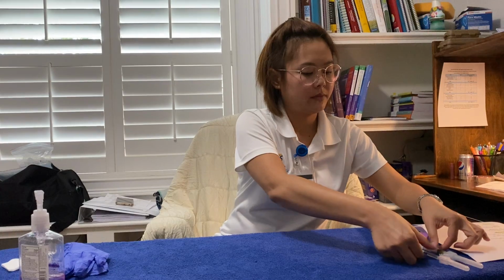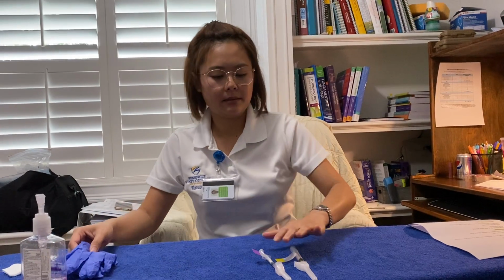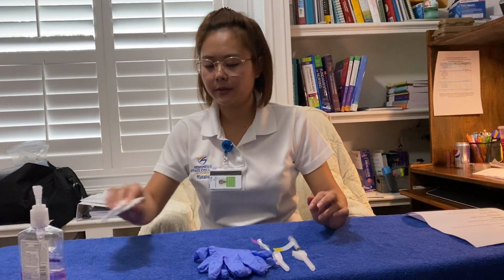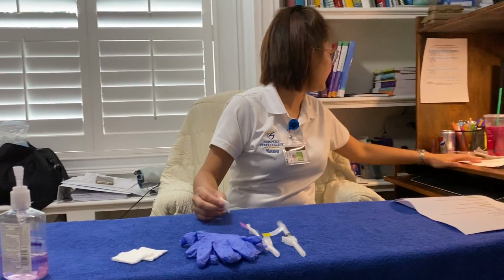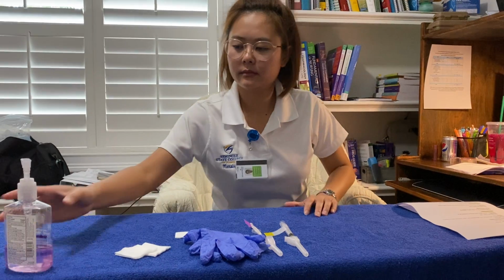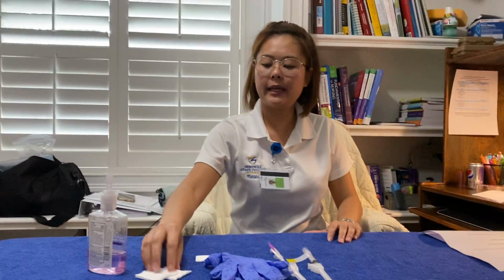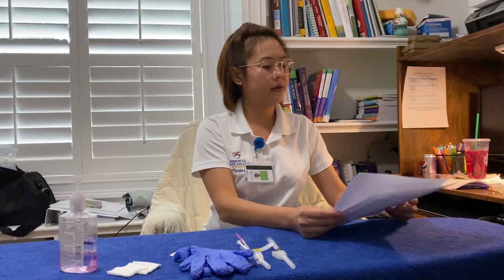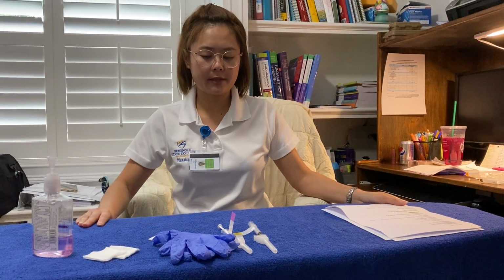Alright, now I'm ready to go to my patient room. Let me gather my supplies: my medication, gloves, 2 gauze, and the alcohol pad that I have here, my hand sanitizer, and my medical records. And in the room there is going to be a sharps container.